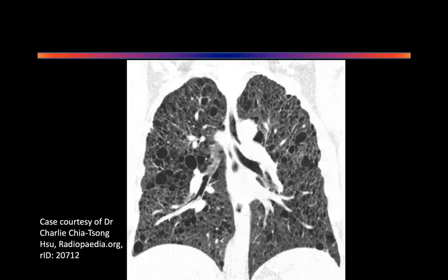We are trying to see lung window. Good. Okay. So just describe what you're seeing. The multiple cysts you said are present, where? Upper lobe? Middle lobe? Right, left, where? The cysts are present bilaterally. On the right side, they are present in the upper lobe, middle lobe, and the lower lobe. The left side also, in the upper lobe, but less in the lower lobe. Okay, fine, I will accept that. But actually, even the lower lobe is involved on the left side.